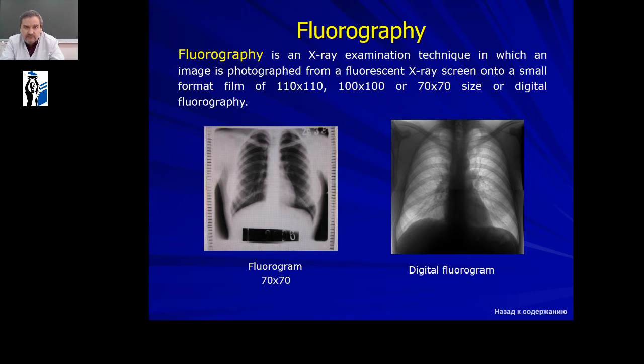Fluorography is an X-ray examination technique in which an image is photographed from a fluorescent X-ray screen onto a small format film of 110 by 110, or 100 by 100, or 70 by 70 size, or digital fluorography.